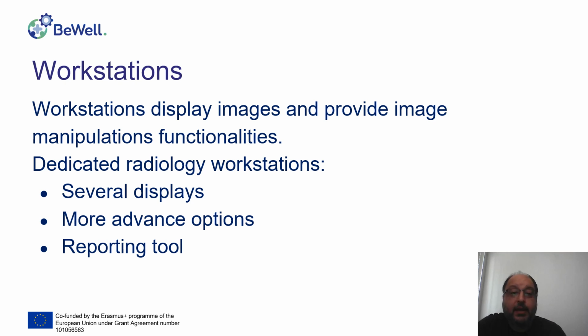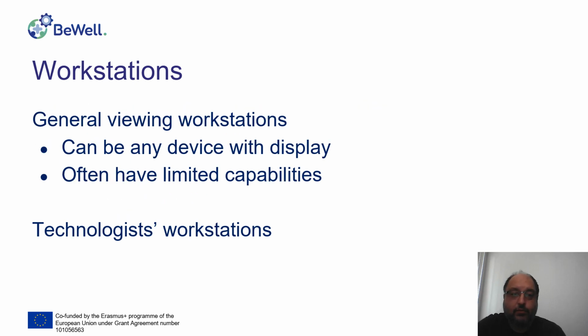They have many advanced options, and they have a reporting tool, and this reporting tool can be, for example, with artificial intelligence or some other technology for voice-to-text conversion to facilitate the work of the radiologist, and this is very useful. The general viewing workstations are normally used outside the radiology, and this can be done on any type of display, and of course they have limited capabilities.